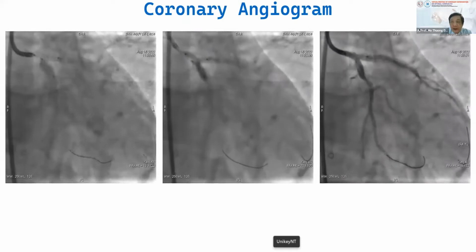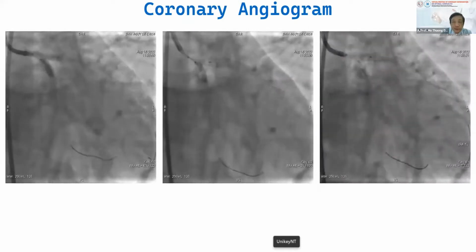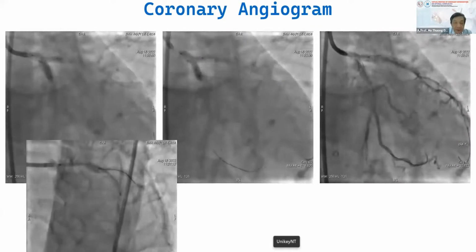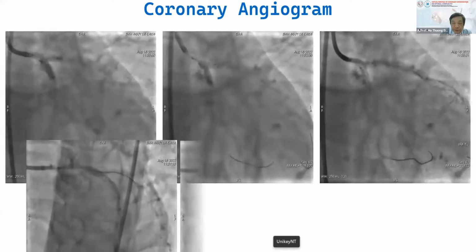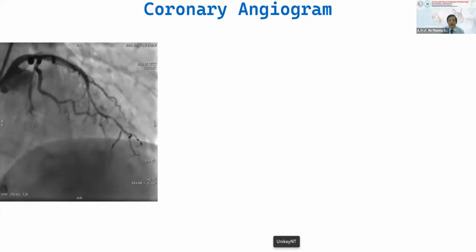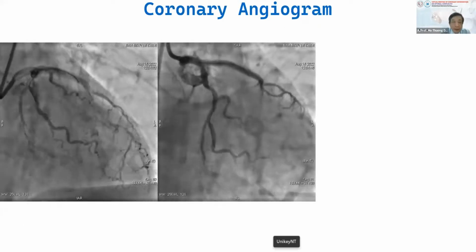and one stent from left main to proximal segment of LAD. Fixing, and we stent in the circumflex, and we prepare stenting from left main to LAD proximal segment. That is the last result. We do optical, we do the final kissing balloon.